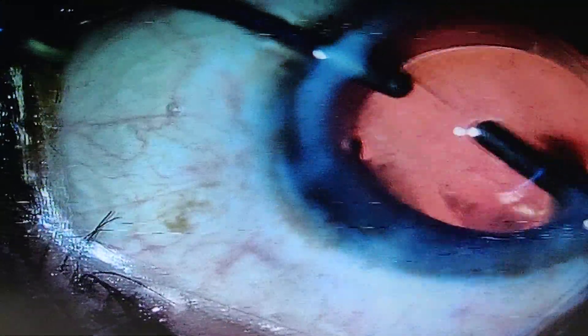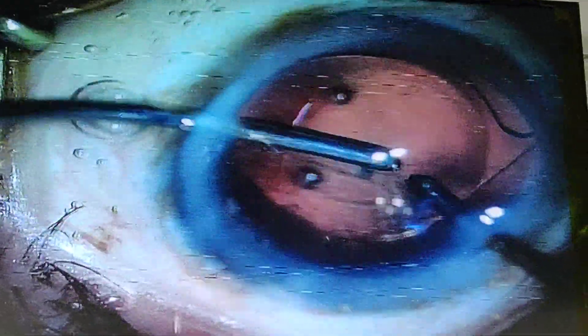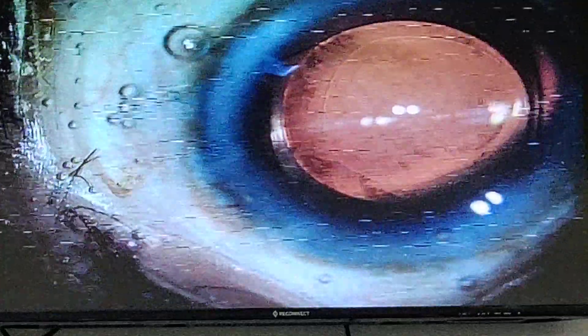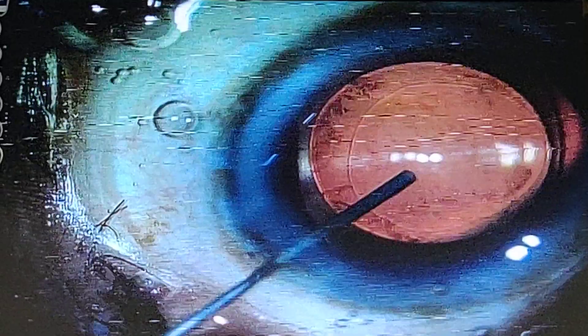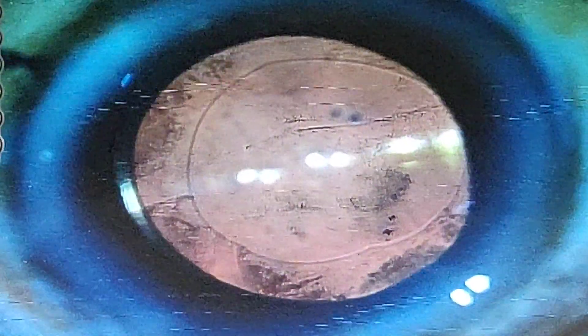The lens does not cause any glare or halos and it provides excellent near and distance vision with no loss of light. The edge function is excellent and there is no incidence of glare or halos. The capsulorhexis is nicely covering the lens edge. You can see the central one-millimeter part which is hexagonal. I am going to show you at high magnification. This is the injection of intracameral antibiotic and moxifloxacin — the surgery is now over.